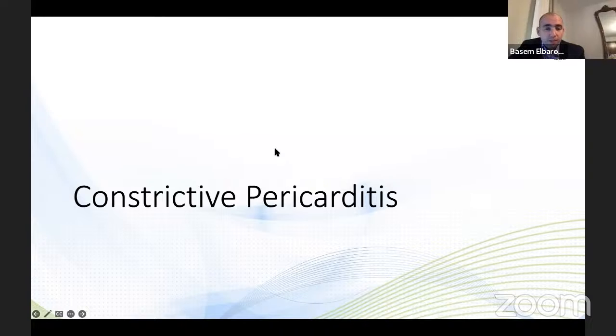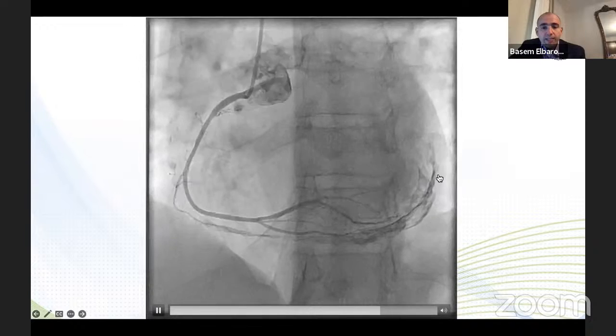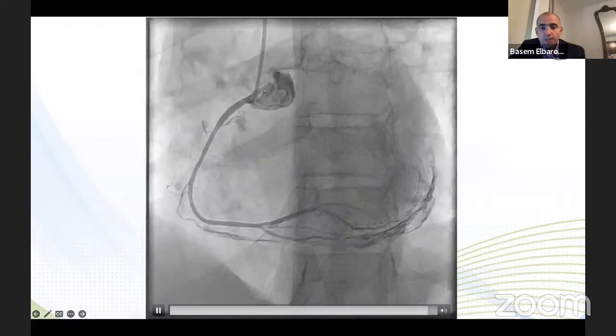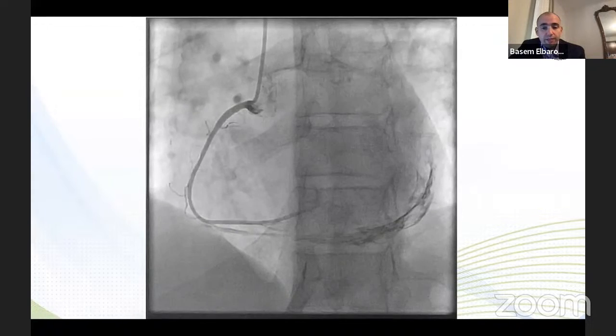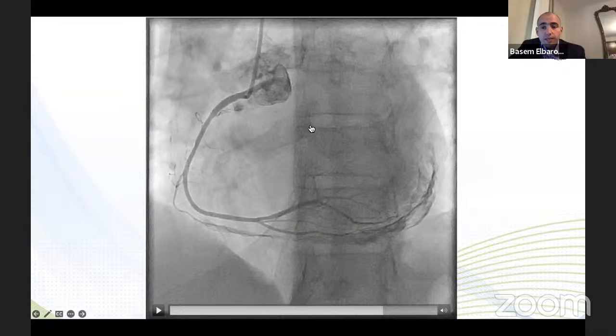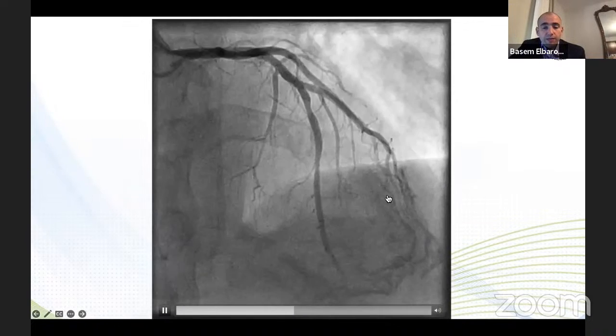I showed this at the Libyan Cardiovascular Society meeting in the Jeopardy; I had this as a final Jeopardy round. Okay, so this is a patient who has heavy calcification in the pericardium. So there is concern that this patient has constrictive pericarditis. All right. How does hemodynamics help you? This is the other image showing the calcified pericardium.